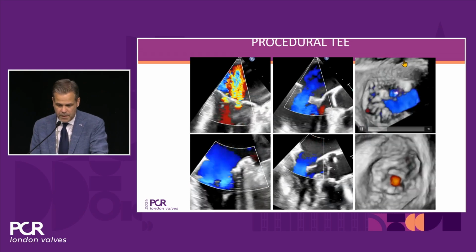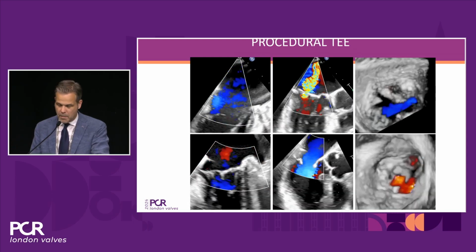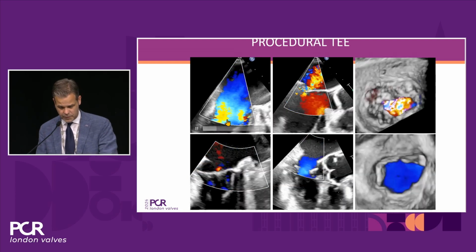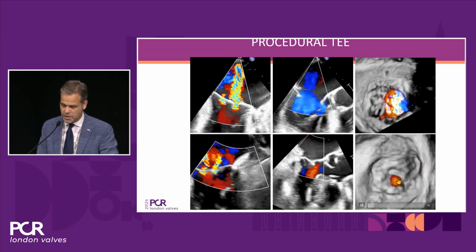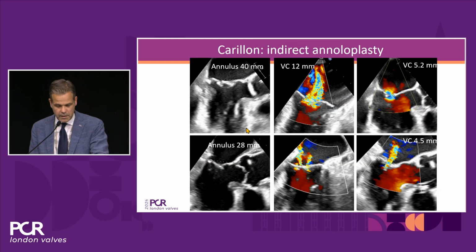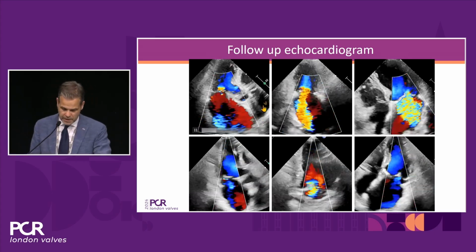And these are already the post-procedural results, so this is in the cath lab. As said, it starts reverse remodeling. Sometimes in the cath lab the MR reduction is not that impressive, but already looking at this, you can see there's a significant reduction in the MR, but also in the AP diameter here. Also looking at 3D en face, we can see a full line of coaptation leak, which goes down to a mild leak here. If we look at the dimensions measured, we can see a significant AP reduction, and a significant decrease in vena contracta in the long axis and the intercommissural view. And again, it starts to remodel over time, and this is already after 3 months.